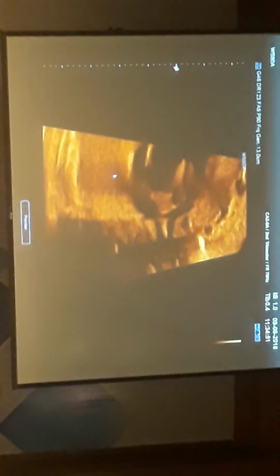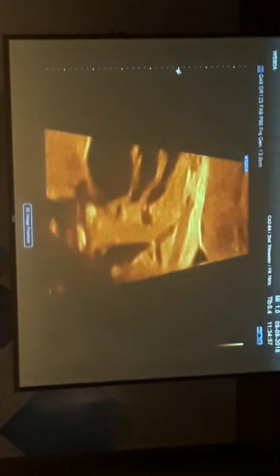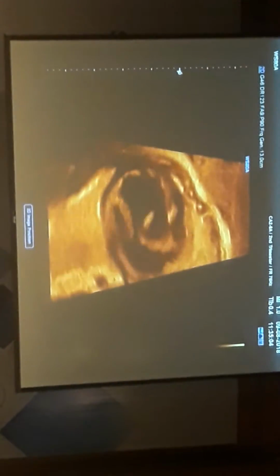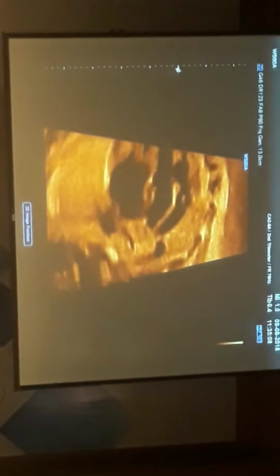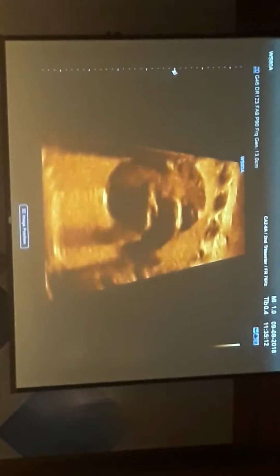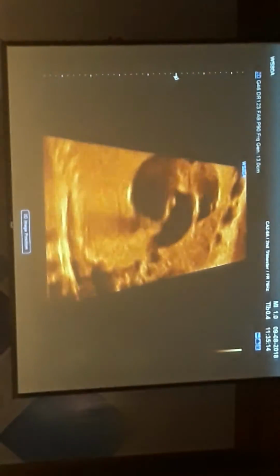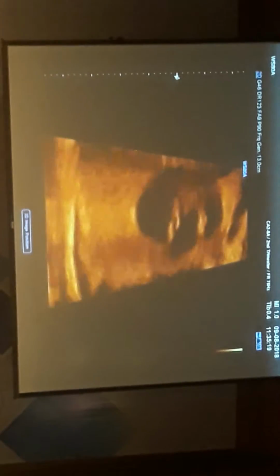So it looks to me like this is a baby who will require aortic arch repair. It's going to be an extensive series of surgeries. This is not a baby we can just do an arterial switch. The prognosis is different for this baby because of the associated abnormalities.